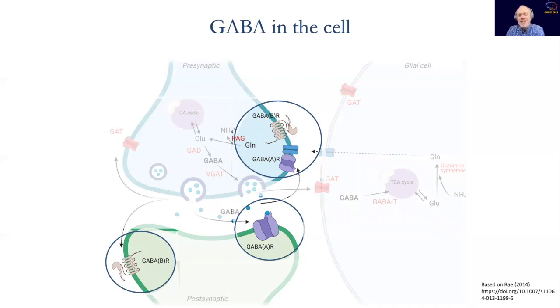So this means that when we investigate GABA function in neurological and psychiatric conditions, we need to take into account that this is a complex system and that interpretation requires acknowledging that complexity, in terms of we don't know where the GABA difference actually comes from. Now, MRS does allow for investigating whether GABA levels are different and altered, which might point to specific issues in neurotransmitter availability, as well as associations with functional relevance to symptoms that might provide important markers for disease. So the presence or even absence of these GABA differences does tell us something mechanistically useful, but we do need to acknowledge that the system is obviously very complex.